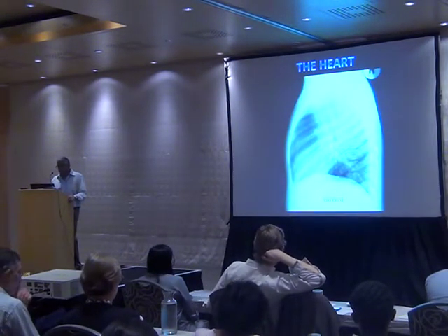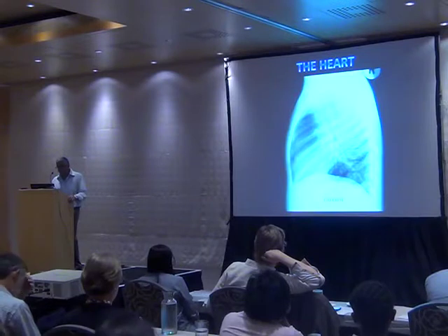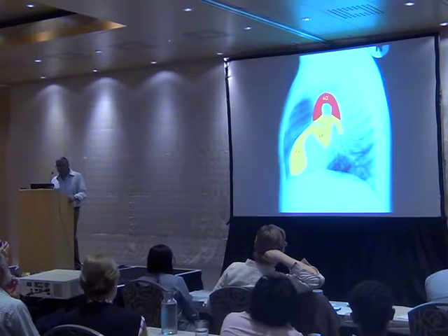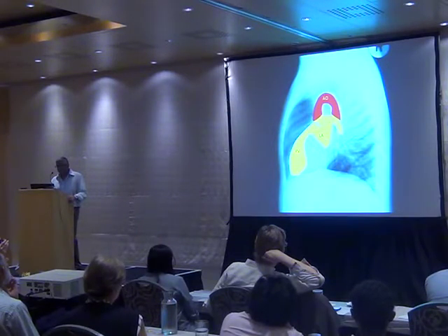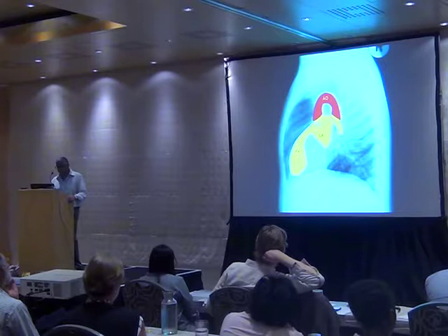On the lateral projection similarly, we need to be aware of what is represented and what is normal. The anterior aspect of the heart and the lowermost third of the hemithorax is occupied by the RV. We also see the aortic arch and the so-called mini arch of the pulmonary artery, as well as the LA and LV.